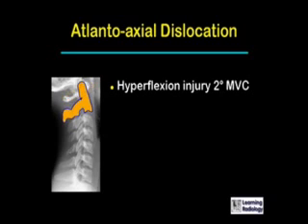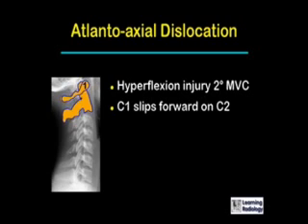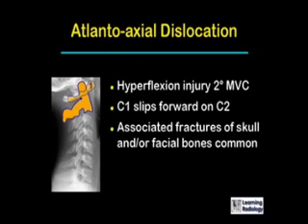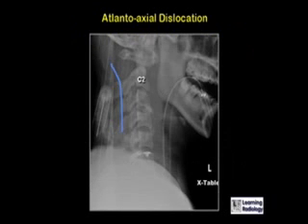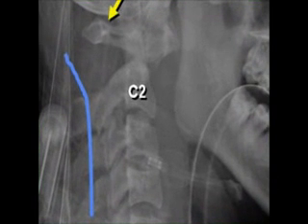Atlanto-axial dislocation: these are hyperflexion injuries usually secondary to motor vehicle accidents. C1 will slip forward on C2. There are frequently associated fractures of the skull and/or facial bones. Neurologic injury is common and these are unstable fractures. Here's an example of an atlanto-axial dislocation.